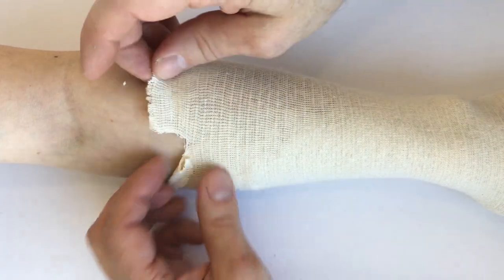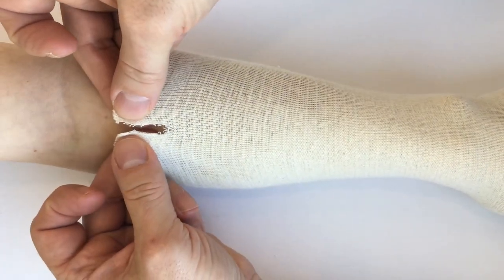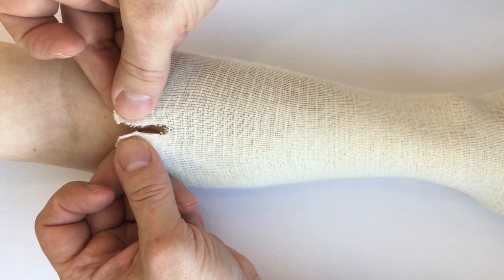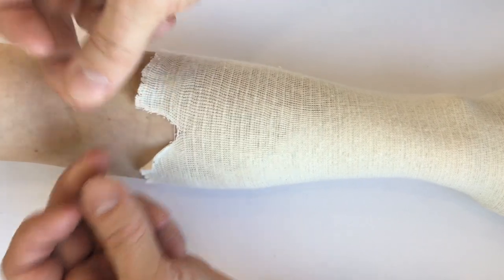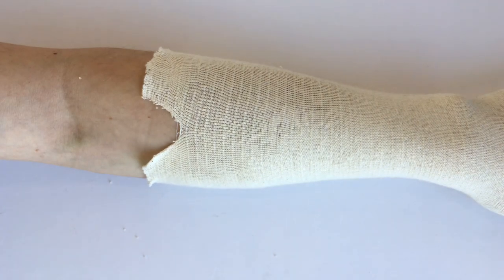The way to avoid it rolling over on itself is just to cut a little slit in the proximal end of the compression stocking — that'll just kind of spread and prevent it from rolling over.